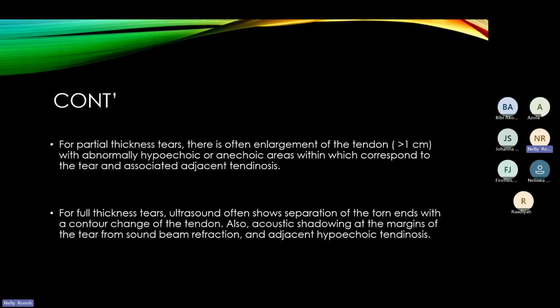And how do you tell what is normal and what is abnormal? You compare with the adjacent Achilles tendon, the other one that is not injured. You put your probe there, you put color, and you see the kind of vascularity it has. Then the one that you suspect could be having tendinitis, with associated peritendinous fluid, you would be able to pick that the color would be much more, and that is hypervascularity.